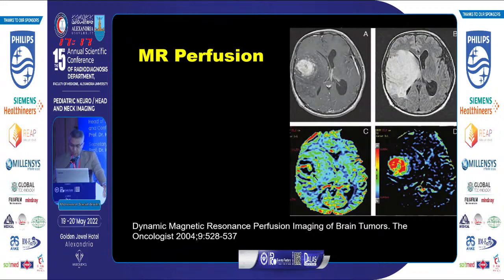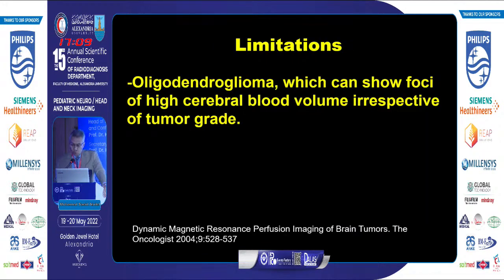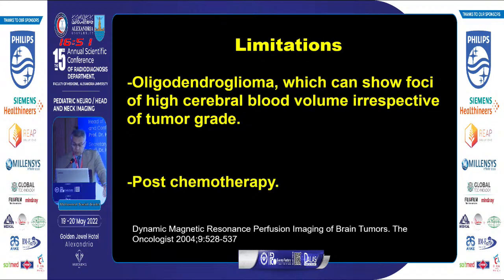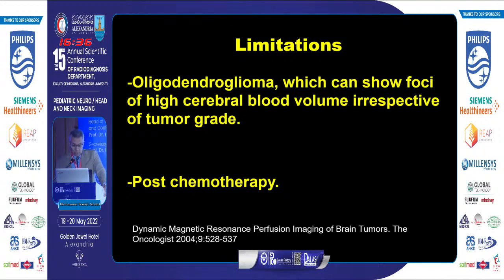This right frontal lobe high-grade glioblastoma multiforme shows a hyperperfused pattern within the lesion. However, perfusion has certain limitations. Some tumors, such as oligodendroglioma, may display foci of hyperperfusion regardless of tumor grade, meaning both high and low-grade neoplasms will show a hyperperfused pattern. Additionally, some chemotherapeutic agents have an anti-angiogenesis effect that leads to a hypoperfused pattern of the tumor despite the presence of active tumor tissue at the operative bed, resulting in false negative results.